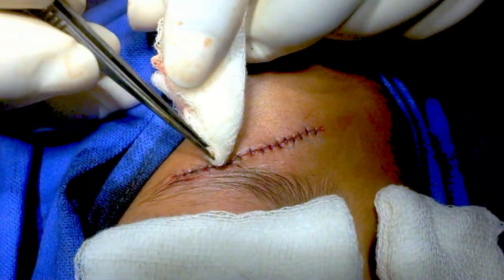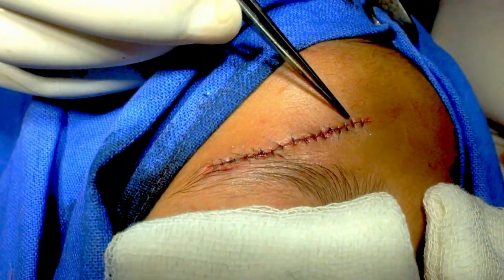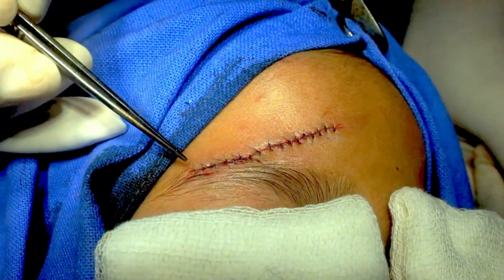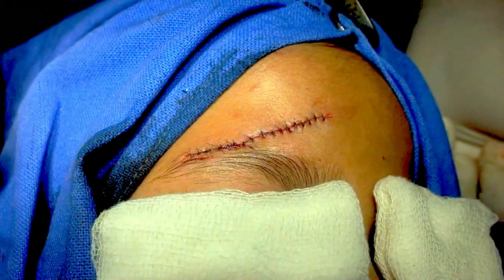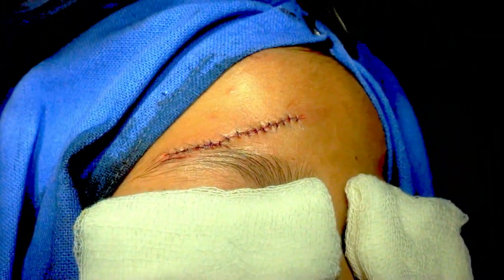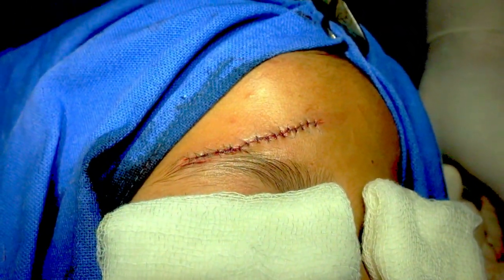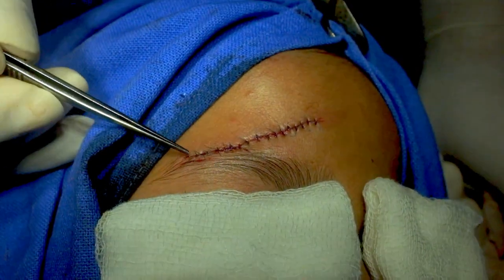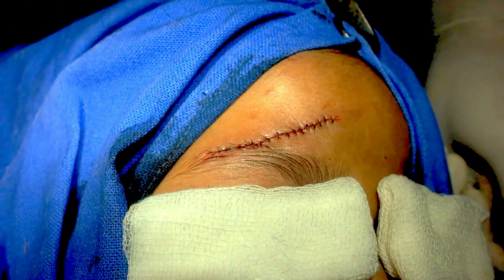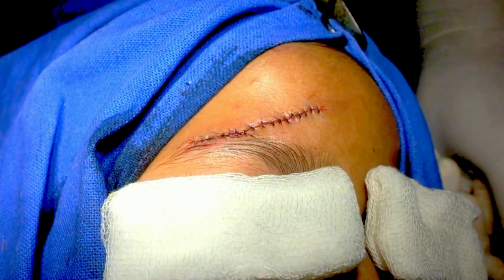We have used eight-zero and six-zero sutures here. I am not going to remove these fine sutures for at least two to three weeks — this will avoid widening of the eyebrow scar. There are two lacerations on the lateral aspect, approximated with eight-zero polyamide or nylon. The remaining six-zero polypropylene stitches will be removed on the sixth or maximum seventh day.